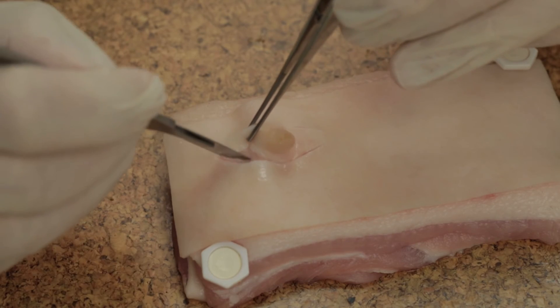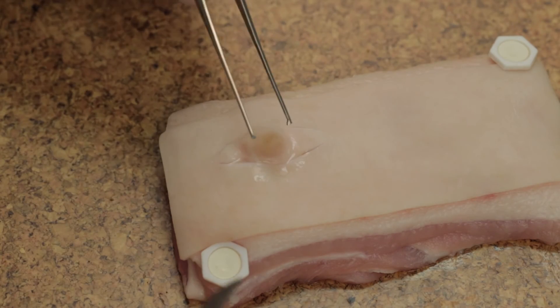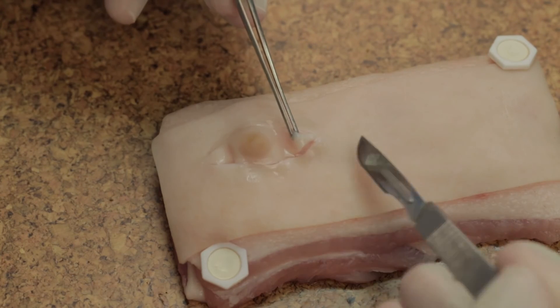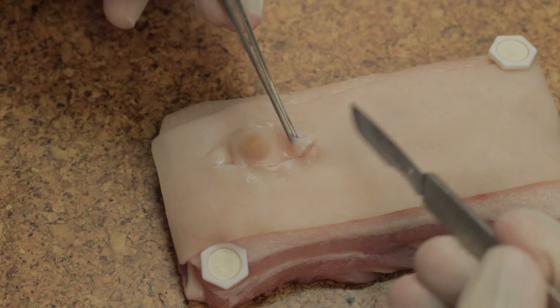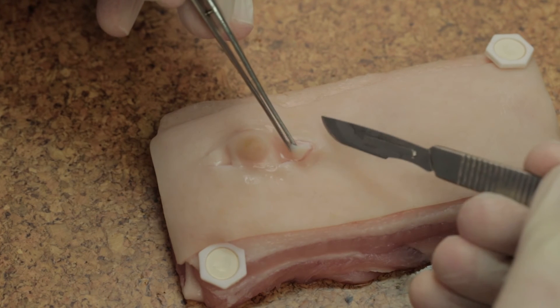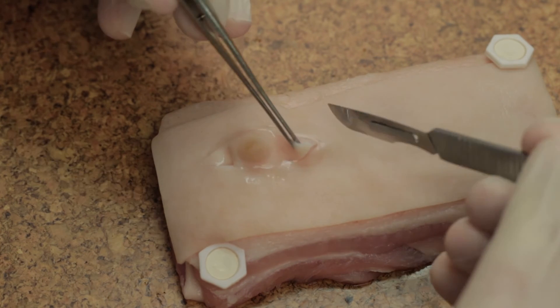Once the skin has been incised, lift the distal edge of the lesion to be excised. Then use your scalpel to peel this off the underlying tissue.